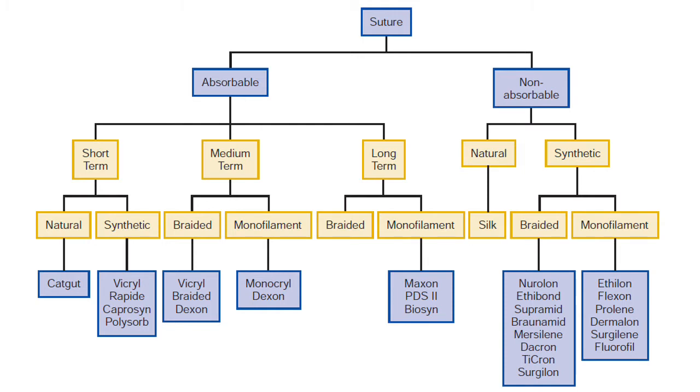All right, so this is a good summary of everything, but it only shows the brand names, basically Vicryl, Vicryl Rapid, Polysorb, Monocryl, Maxon, PDS II. If you're not yet well versed with it, which I don't expect you to be, of course, it's fine. Do you have to memorize this? Yeah, for sure. But focus on the suture materials that I will be discussing, and don't concern yourself with the others because you don't commonly use them, right?